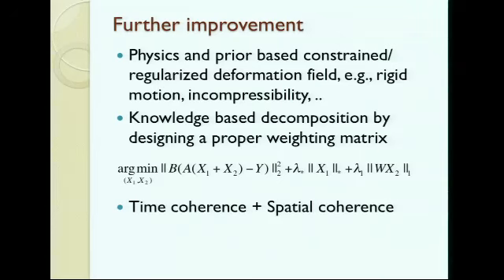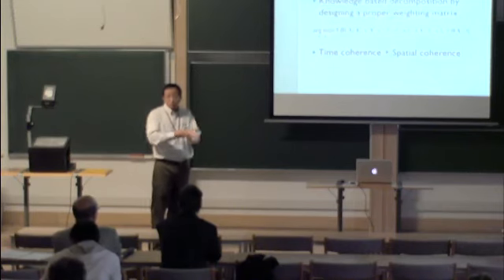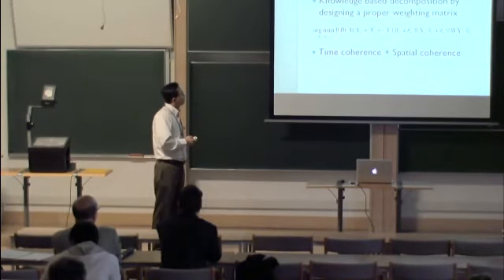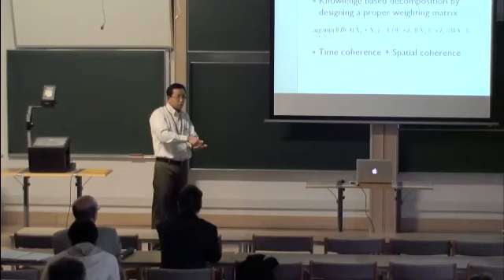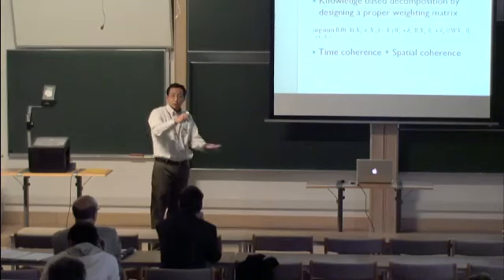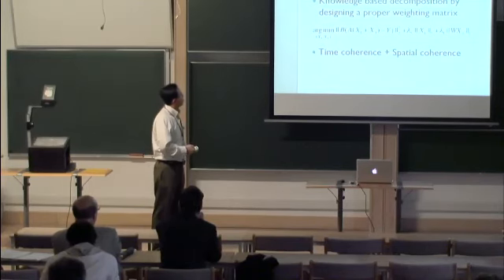So I can put in a weight saying which measurements, in what region or in what direction, are more trustable than others. Otherwise, this mainly depends on what happens most, and many times if you have too many bad images and pixels, those bad pixels will affect the outcome.